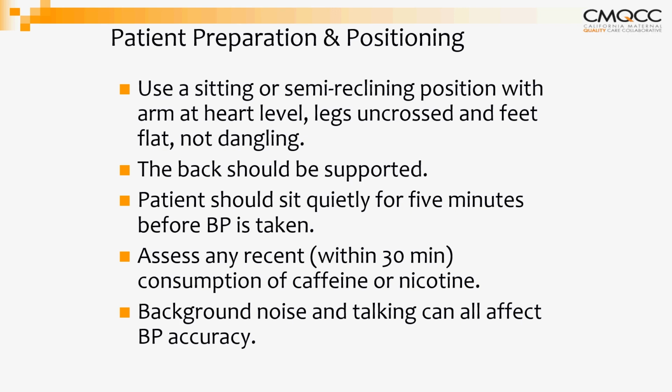Now, these are practices that we really need to discourage, and we really need to make sure that our staff are not doing them, particularly as we are starting to monitor how severe range blood pressures are treated and whether it's done in a timely manner. But if it's not done correctly in the first place, then we may miss a lot of things. Patients should be sitting upright or in a semi-reclined position, arms at heart level, legs uncrossed, and feet flat. Her back should be supported and she should be sitting for 5 minutes before blood pressure is taken.